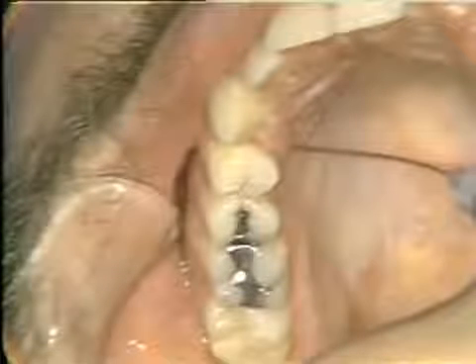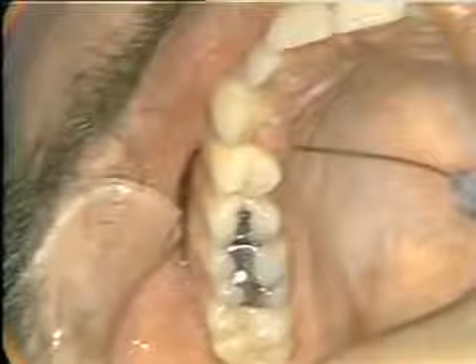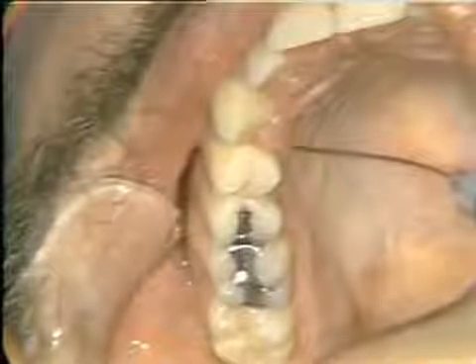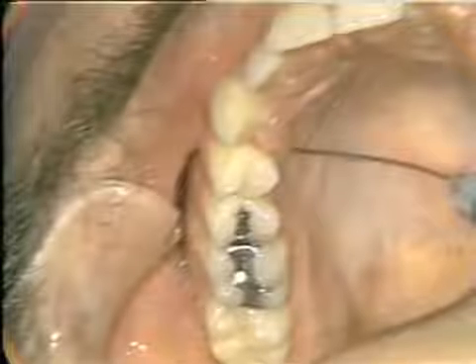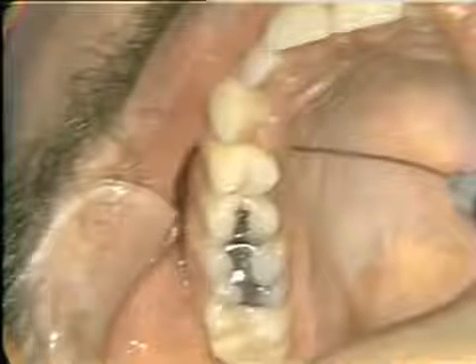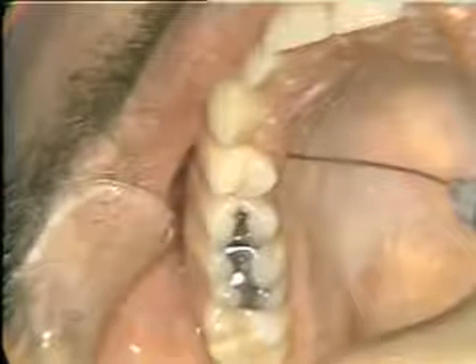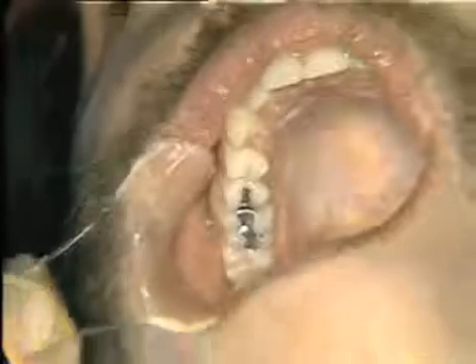And then with quite a little pressure on the plunger, we just literally need to inject a few drops of solution into the palatal soft tissues. And again, they are blanching a little bit. It doesn't show too well here, but they are, believe me. And that's all we need, just a few drops, and then out quickly. And that will allow instrumentation on these immediately adjacent palatal soft tissues of the first bicuspid.